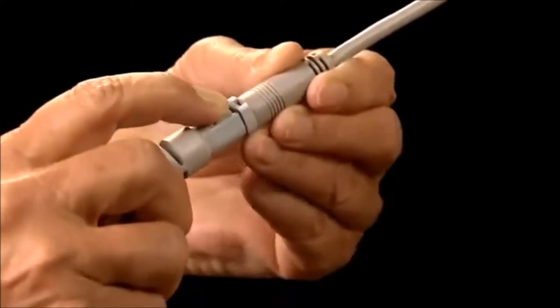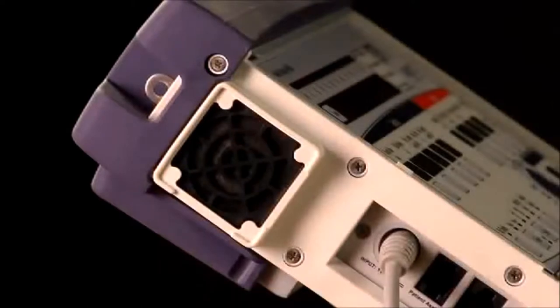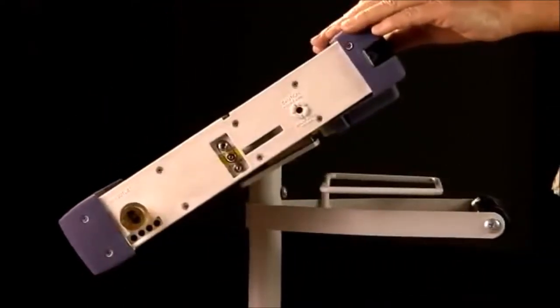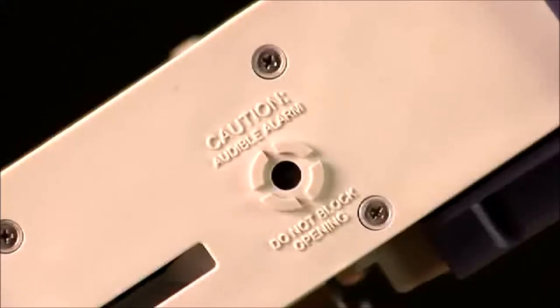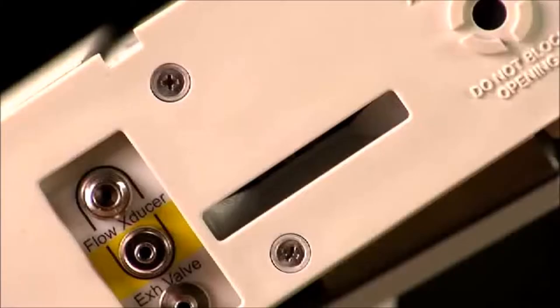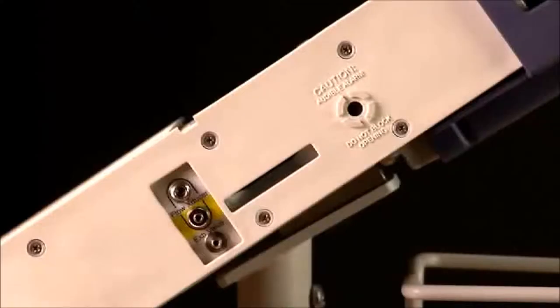Above the ports is the fan. It is important not to block the fan. On the right side of the ventilator, we find the opening for the audible alarm. It is important not to block this opening since the alarm volume would be reduced. Under this, you will notice a slit-shaped opening that is part of the internal air circulating system. Do not block this area either.